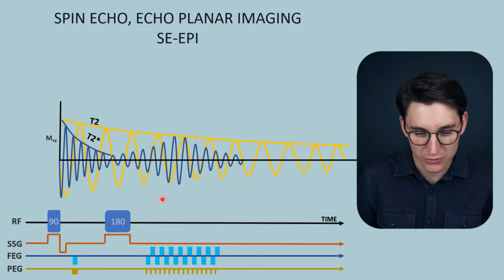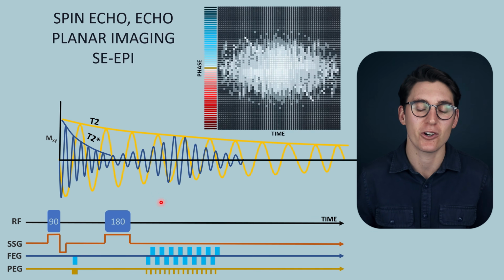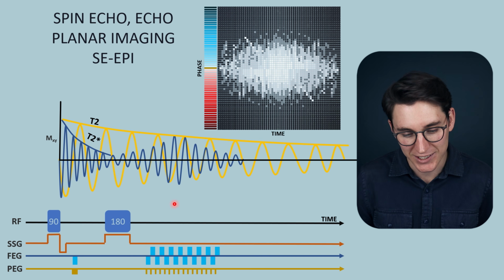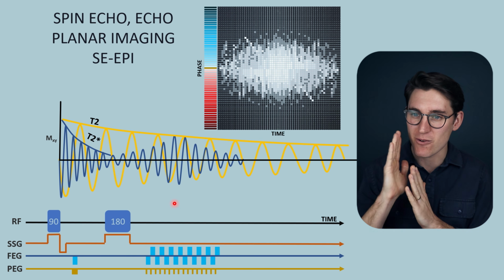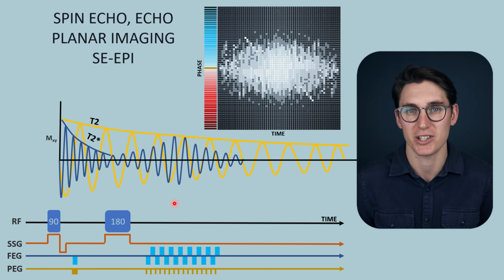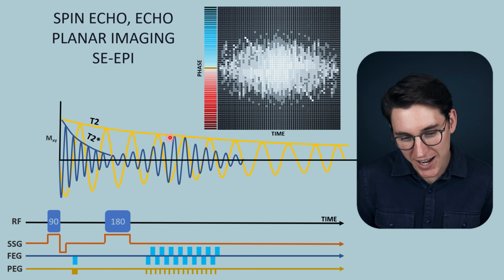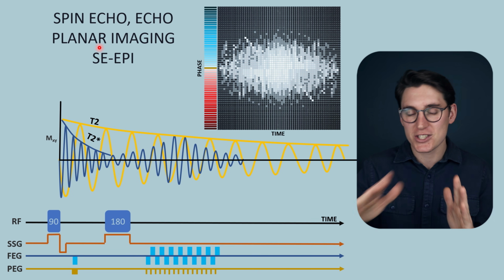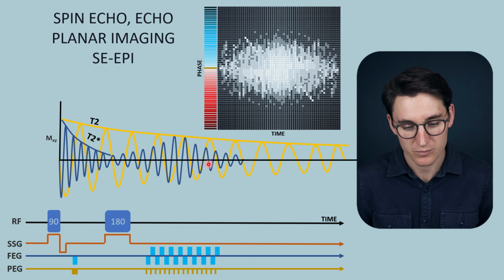This allows us to fill K-space in a slightly different way to how we fill the gradient echo planar imaging. Remember, the echoes that we are generating here are still gradient echoes. We are still generating those echoes by rapidly shifting the frequency encoding direction. The degree of signal that we get is higher in this case because of the spin echo that we've generated. We're not purely sampling free induction decay, we're sampling this echo that we've generated.